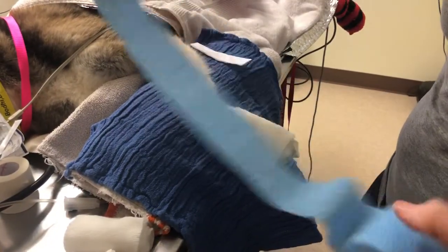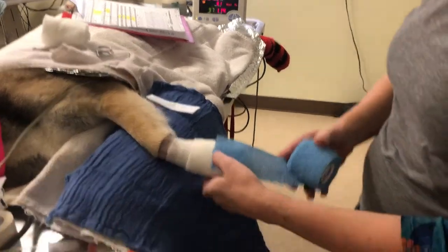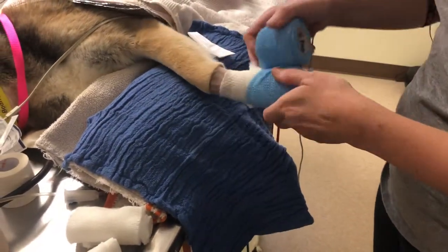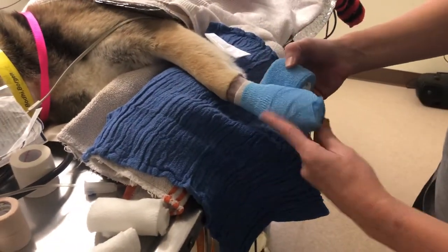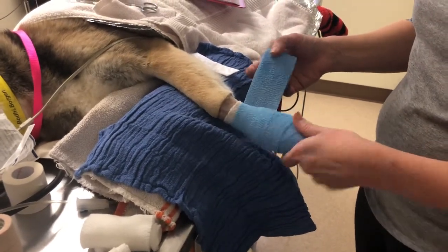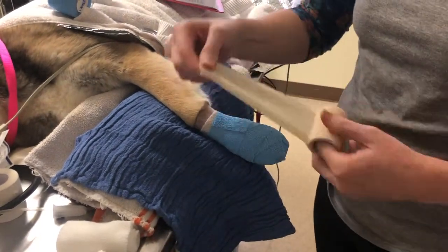Then I'm going to put vet wrap or Coban on. I loosen it up first and then rewrap it so I'm not putting a lot of tension on this. I start by covering the foot and then start my figure-eight wrap up the foot. I don't put this part directly on the skin. I'm not pulling hard — I'm just laying it on itself and it's sticky so it'll hold.